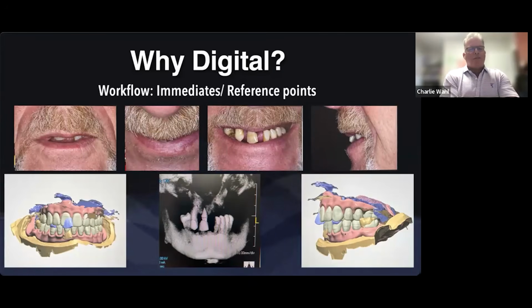And so, yeah, it takes a little bit longer, but I want to know all those answers. Whether we are doing final treatment as complete dentures, final treatment as All-on-X, or some combination of those, my process is I want to get them into immediate dentures.